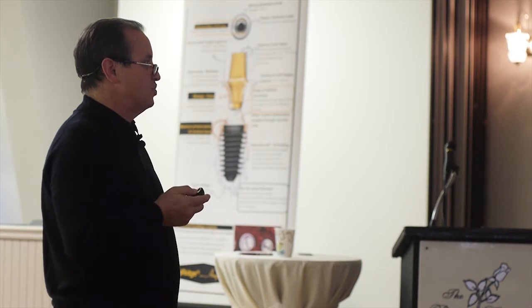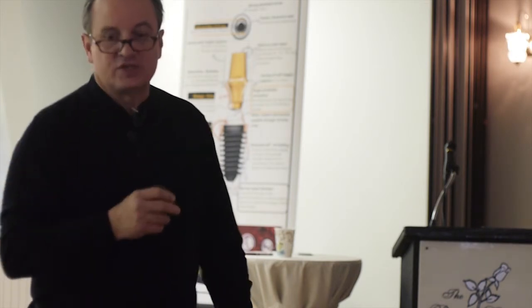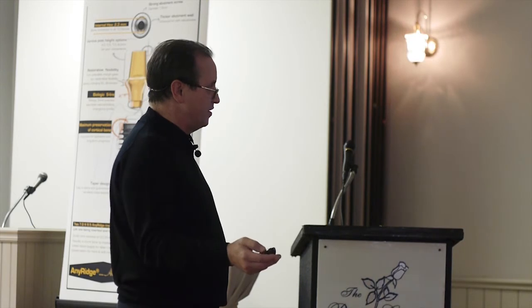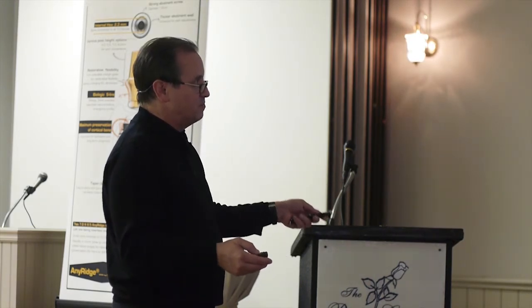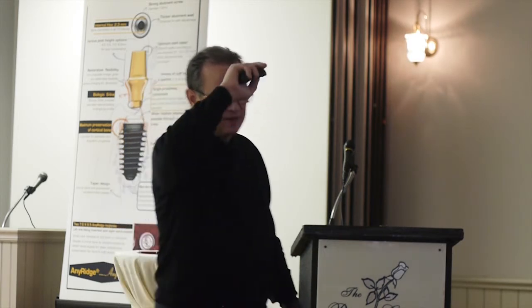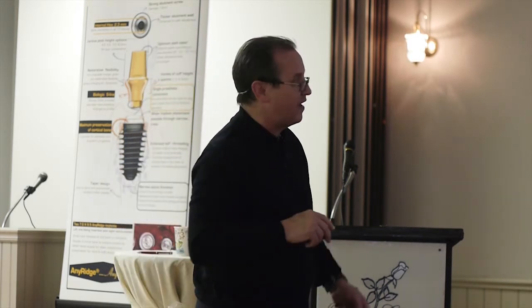And the next one we'll show is just to show them where the anticipated implant sites are going to be. So we're thinking about first molar occlusion on the right, first molar occlusion on the left, 3-unit bridges in the front. But once again, using this program, and I gave you that link at the last course. Remember, it's called Dental Flash.